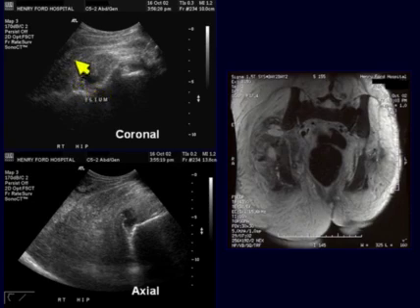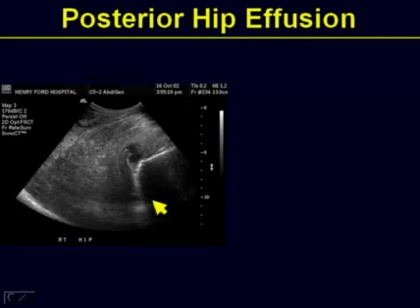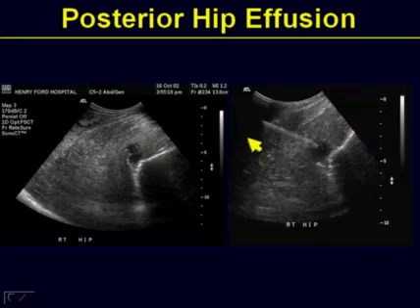And here you begin to note that there is a hypoechoic collection of fluid surrounded by a rind of soft tissue representing this abnormality on a, if you wish, long axis view, and then on a short axis view, again giving you that orthogonal orientation and triangulation that you'll need as an imager. Once you've identified that, we'll stay on the axial view, and again you have your target visualized as a hypoechoic lesion. All you need to do now is introduce a needle, and very clearly you could see the entire shaft of the needle.